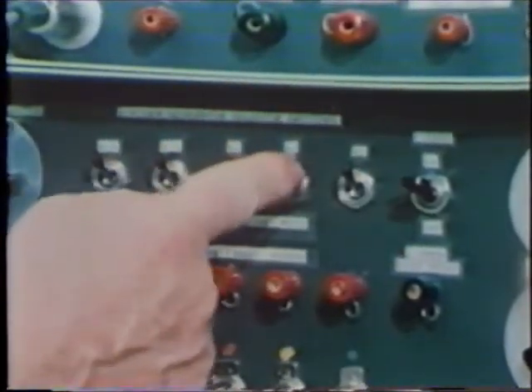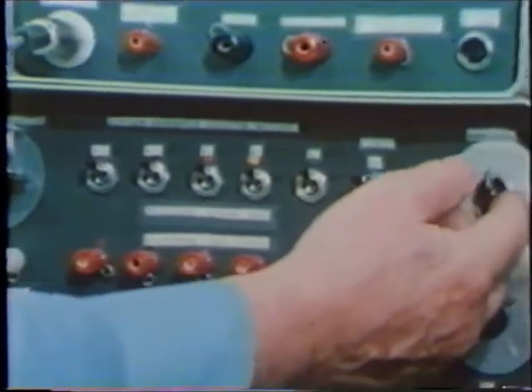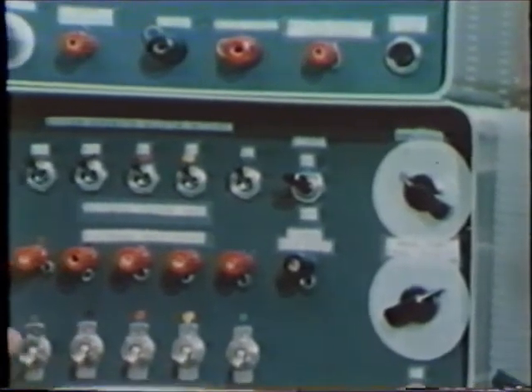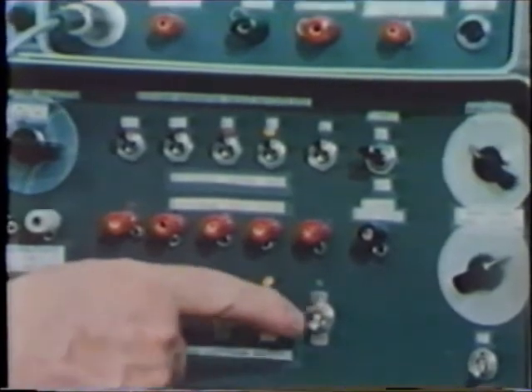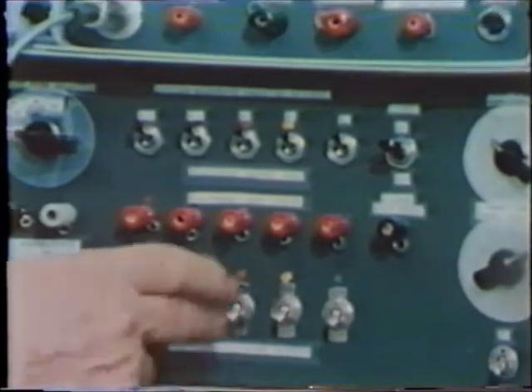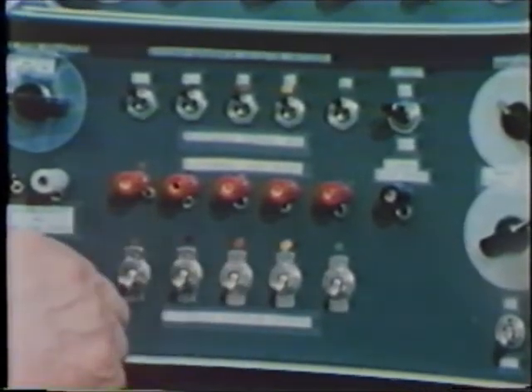This meant that we could bring these frequencies down into the area of Grazer's best response. This was the area of 30 to 120 cycles per second. For example, if we used the 10 times reduction, we could bring the 500 cycles down to 50 and the 3,000 cycles down to 300. We could select various combinations of electrodes, such as 1 to 6, or 1 to 2, 2 to 3, 3 to 4, and so on.